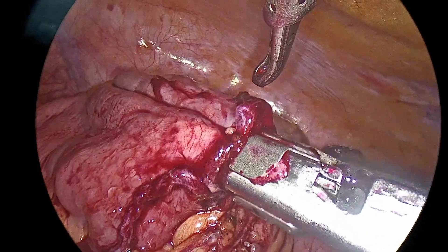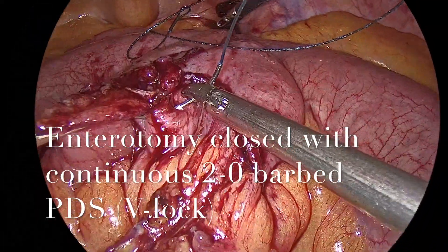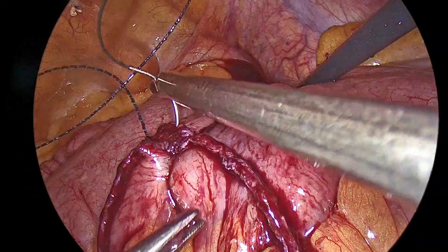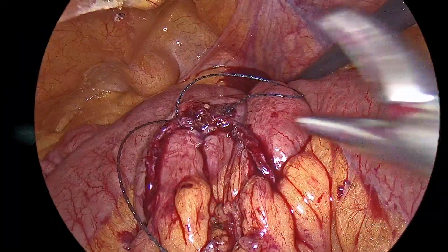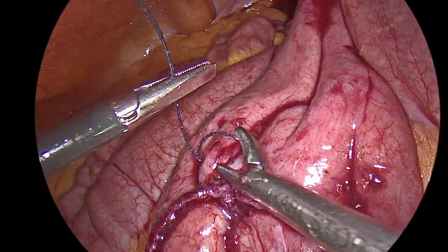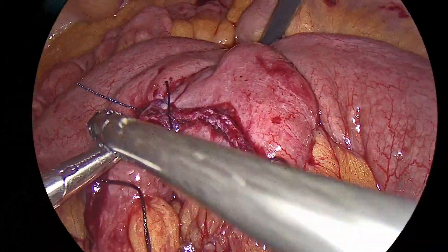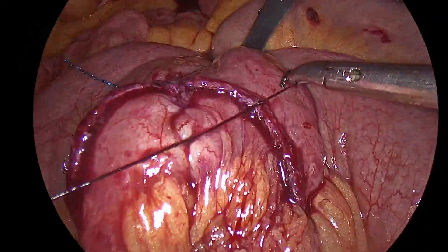Before locking the stapler, we make sure we are holding the antimesenteric part and not going too close to the mesentery. We observe from inside and outside, and once fired, we ensure absolute hemostasis. The enterotomy through which the stapler was inserted must now be closed. We close it with a first-layer 2-0 PDS continuous suture, using a self-fixating barbed suture — the V-lock. After completing the V-lock closure and fully closing the enterotomy, we reinforce with a few interrupted 3-0 silk Lambert's seromuscular stitches, and take a stitch at the distal part of the anastomosis to support the staple line.